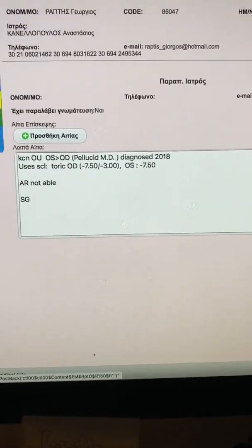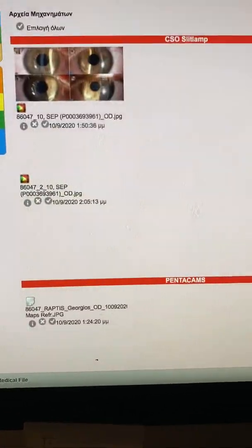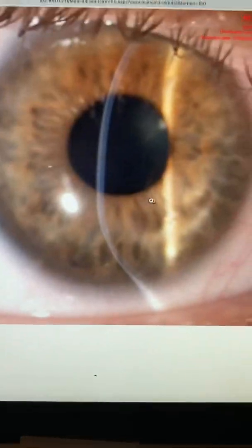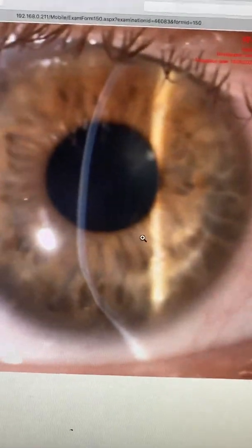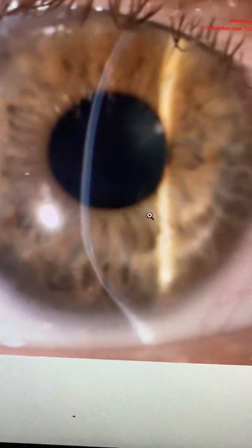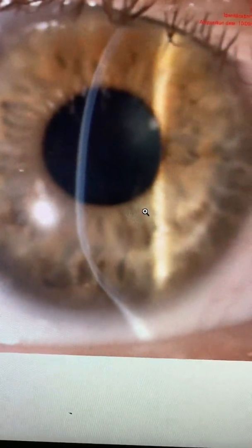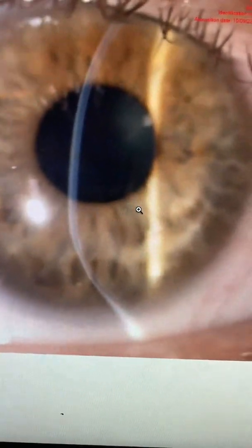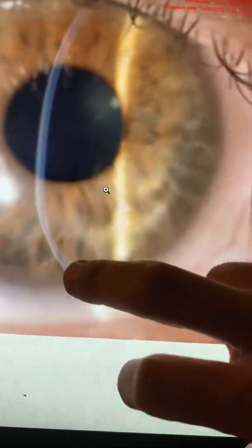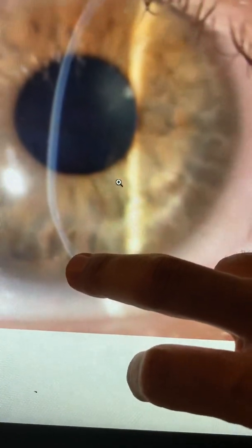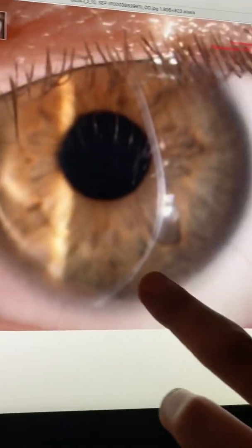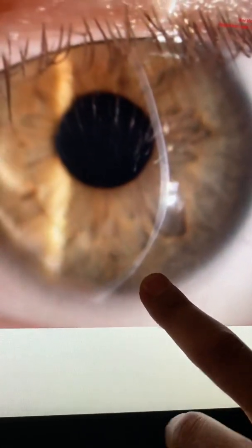And we're going to look at the images. These are the slit lamp pictures of this quote-unquote keratoconic patient. And here things are starting to get funny because you can see here, even on slit lamp, that the thinning is mainly in the very inferior cornea here and in the left eye here.